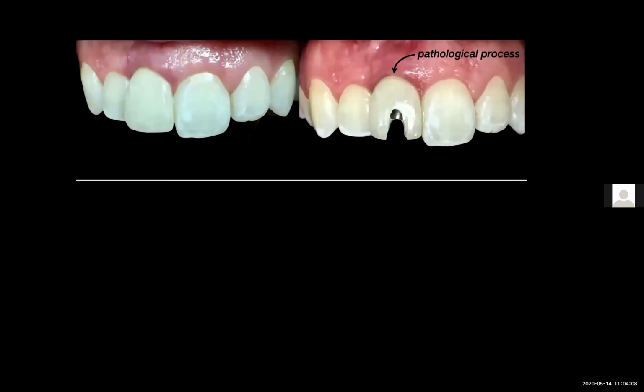So here are a couple examples of poor anterior implants as a result of surgical and restorative errors. The first example involved an implant and restoration on tooth number 8. We see significant asymmetry at the incisal edge due to restorative errors, the provider not fully seating the impression coping all the way down to the implant during the final impression appointment. Also, the implant position was angled too facial, and this led to the resorption of the crestal bone and the buccal plate, which manifests itself as a form of chronic inflammation, also known as peri-implantitis.